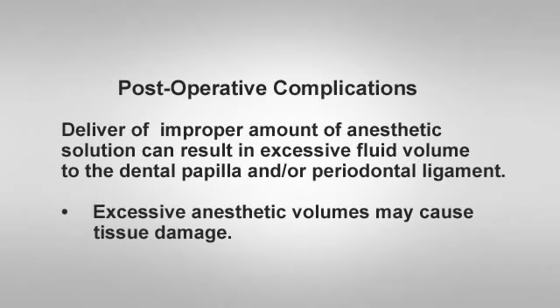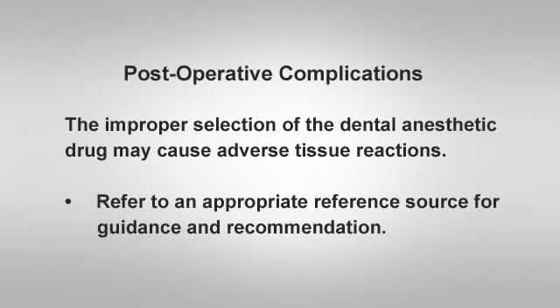The second general reason for post-operative discomfort may be as follows. It may be the result of delivering an improper amount of anesthetic solution, resulting in excessive fluid volume in the area of the dental papilla or periodontal ligament, causing tissue damage. The third general reason for post-operative discomfort may be related to the improper selection of the dental anesthetic solution used while performing the intraligamentary PDL injection.